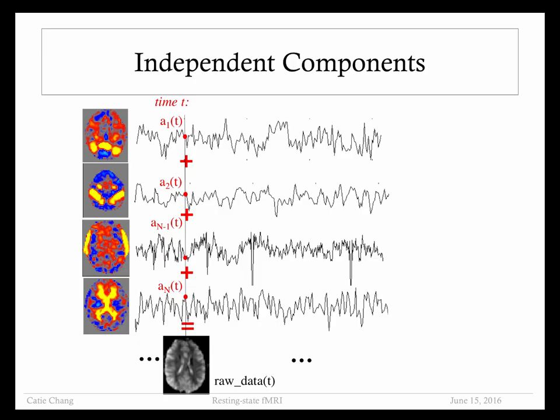And so I mentioned before that one use of ICA is for noise reduction. One nice feature is that it's got this built-in denoising mechanism in the sense that it will tend to conveniently peel off certain large artifacts into separate components. And so by definition, once it's done this unmixing, the remaining components don't have as much of that inside of it.